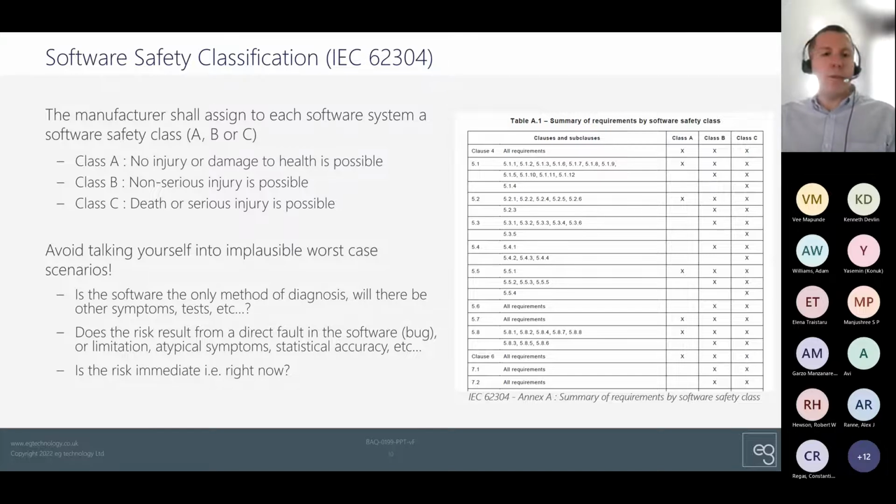A corruption of the image was absolutely immediately obvious to anybody using the system. And in typical cases, there will be other clinical indicators which will be assessed as part of the clinical diagnosis as well. So all of these things serve to keep the overall risk of the system down. In clinical trials, it was then shown for these imaging devices, they were shown to improve the standard of care.